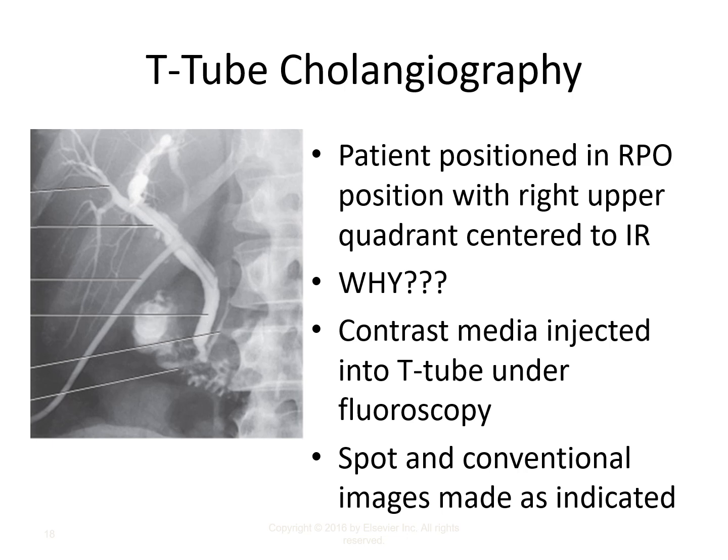The second line, the black and white line down, is the common hepatic duct. The third line down is the T-tube, which is cannulating the old remnants of the cystic duct. The fourth line down is the common bile duct. The fifth line down is the pancreatic duct. And the sixth line down is the duodenum. Okay.